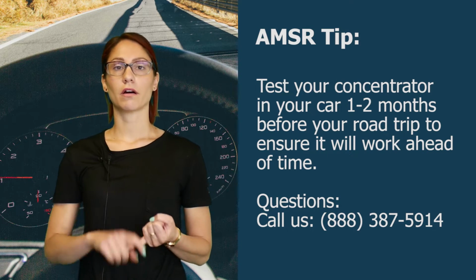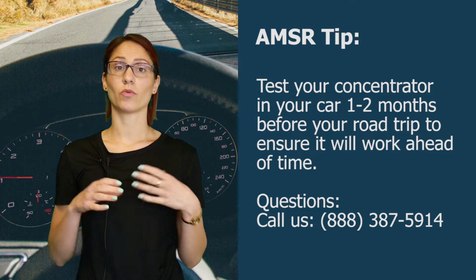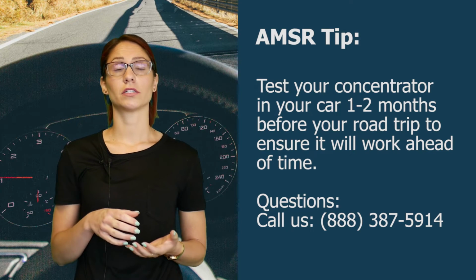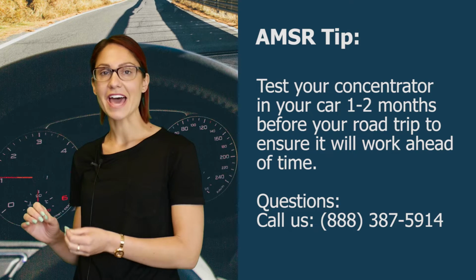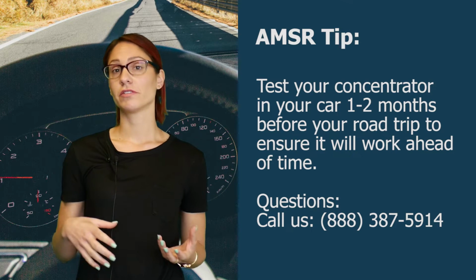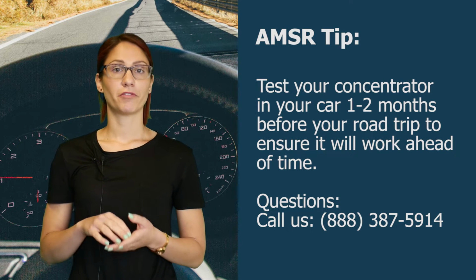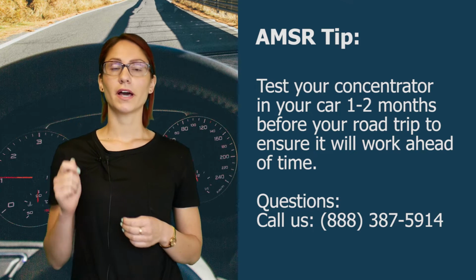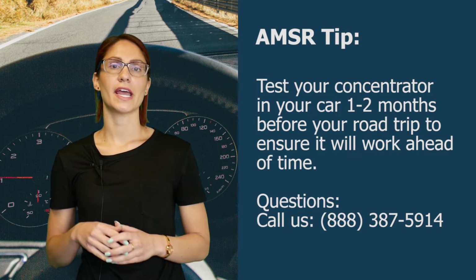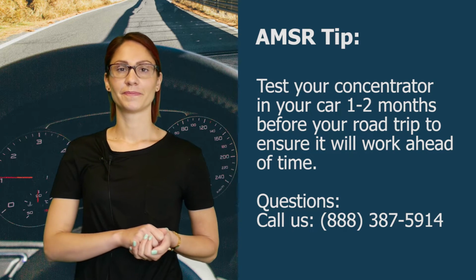We want to make sure that your car powers the oxygen concentrator, is charging the battery, and everything works like it should. We have heard stories of some oxygen concentrators draining the battery on your car. So typically this happens if you're using a continuous flow portable concentrator, but we definitely recommend before your trip, turn on the car, plug in the concentrator, make sure everything works properly, you're not draining the battery, and your car can properly charge your portable concentrator.